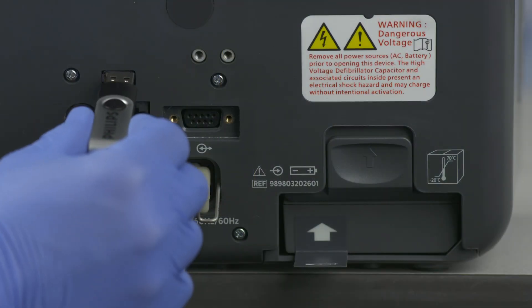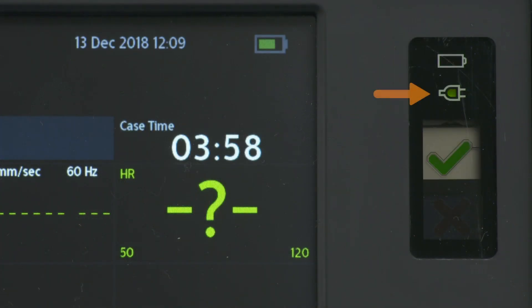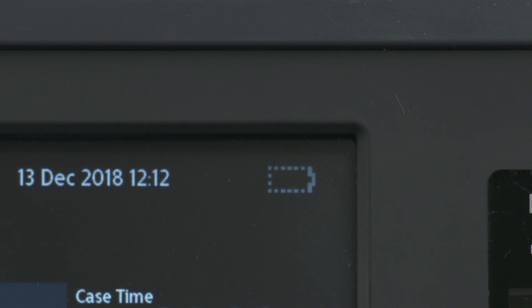The USB data port allows you to save data for transferring patient information or to import configurations and new software revisions. Connect the wireless module connection here. On the front of the device, an LED indicates that AC power is connected, and another indicator lights to tell you the battery is charging. A screen icon indicates the presence of a battery and displays incremental charge levels as the battery drains; a different icon indicates no battery is installed.